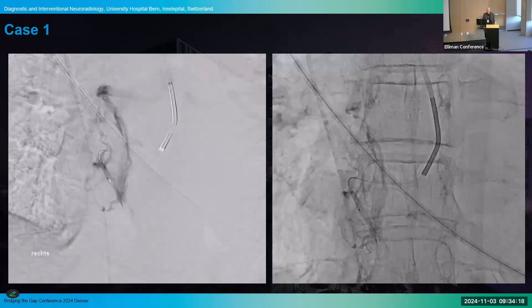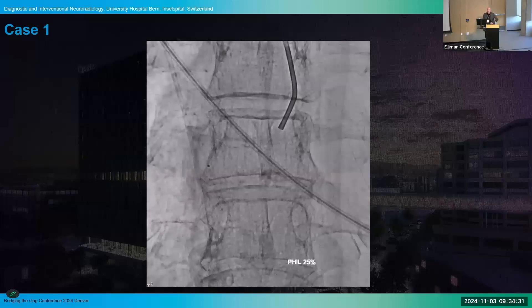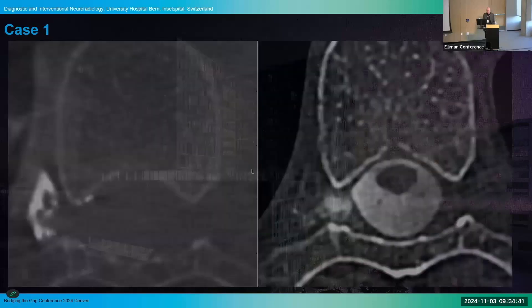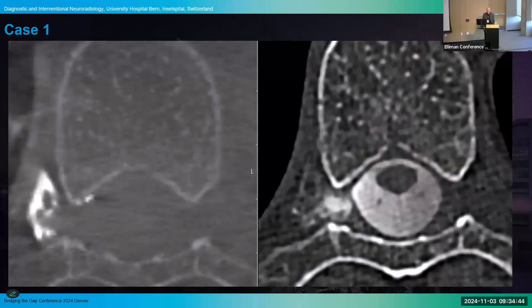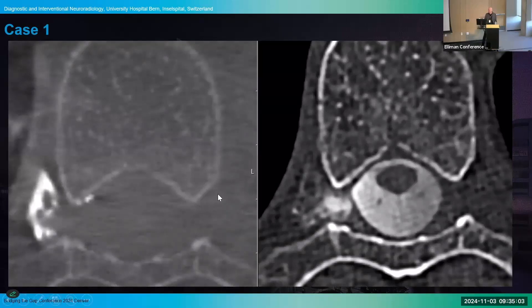You take whatever embolic agent you have and are allowed to use in your country — because that's an issue, especially in the United States, as I've heard. In this case, we inject the embolic agent and try to fill all parts of the CSF venous fistula to really occlude the venous draining part. We perform flat panel imaging afterwards to see where the embolic agent really is, and then compare it to the myelography — confirming the embolic agent is inside the vessels we tried to occlude.